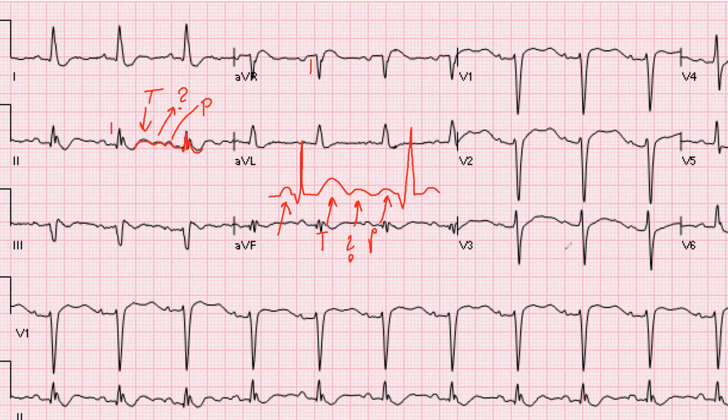This is an event of the ventricle happening at late repolarization of the posterior-basal area of the ventricle. That's the official terminology. So it's a posterior basal ventricular depolarization or repolarization?